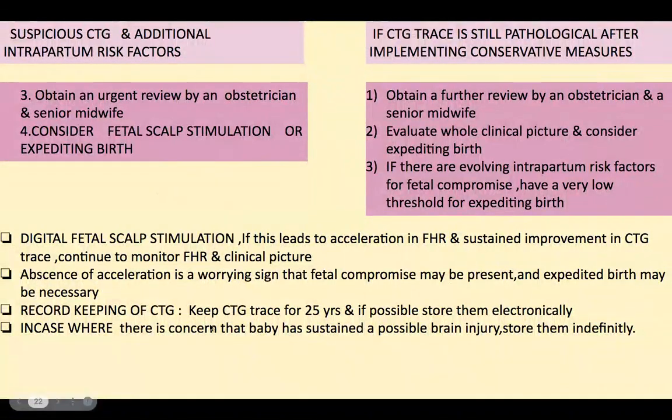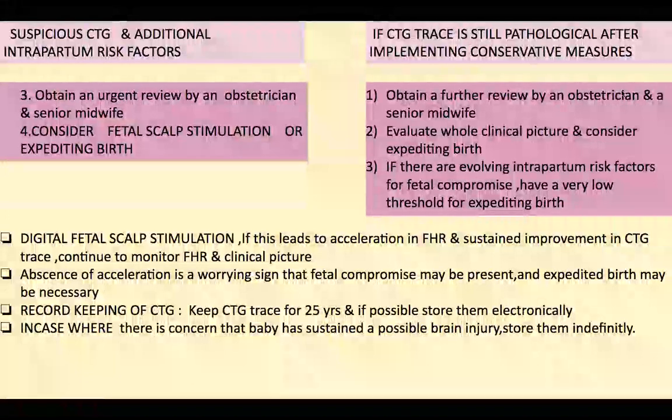Now the record keeping of the CTG, this can come as a single best answer question. Keep the CTG trace for 25 years. If possible, store them electronically. In case there's a concern that the baby sustained any brain injury, store them indefinitely. This is a frequently coming single best answer question, right? Is everything clear, friends? Please reply in the chat box.